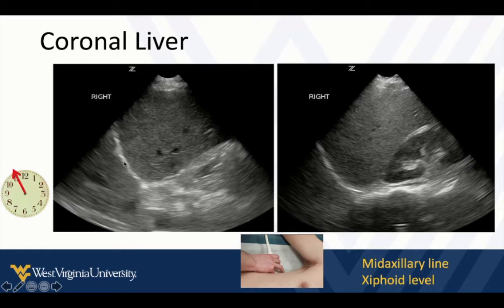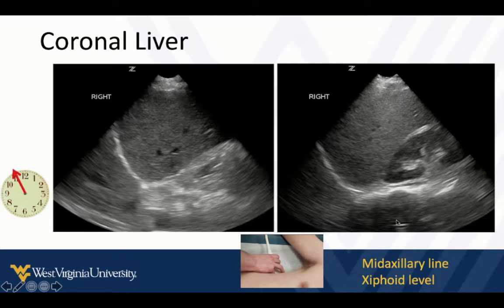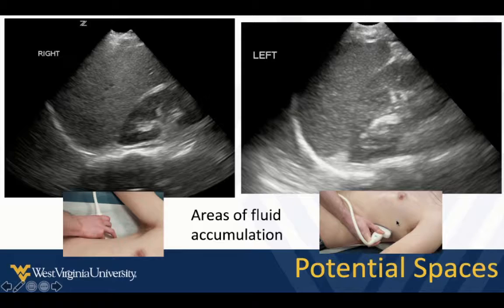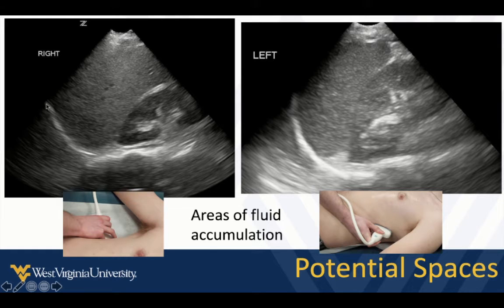We see the diaphragm here. We don't really see anything going on in the lung if it's normal, and then as we move down and fan up or down, we may identify Morrison's pouch here. These are potential spaces under the diaphragm or in Morrison's pouch on the right. On the left side it looks fairly similar with the spleen. The potential spaces are here: Morrison's and sub-diaphragmatic.